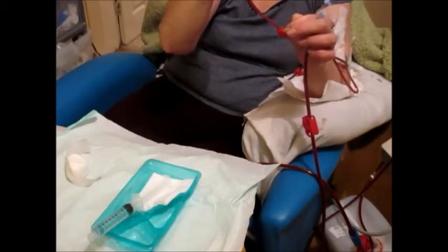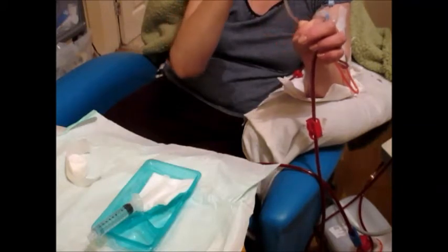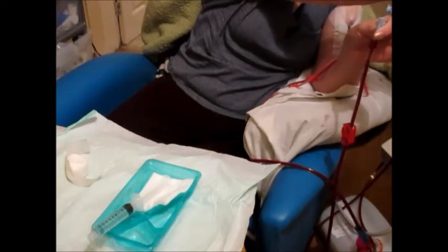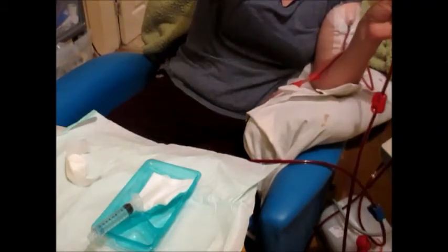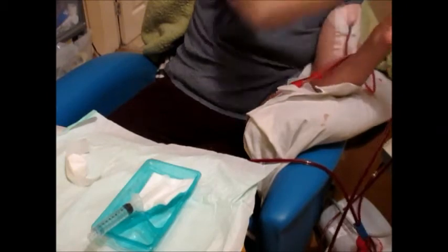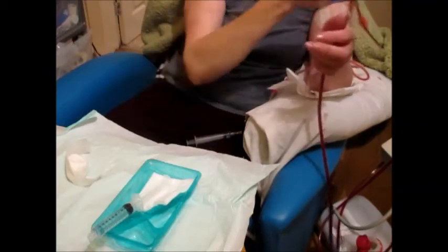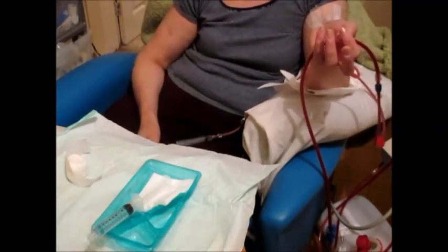Be careful that there are no air bubbles going in. If there are little air bubbles, just pull the syringe up slightly. If you keep the syringe upright as well, you're less likely to introduce any air. Now I'm just going to connect the substitute line back over to the arterial line to wash my blood back. You need to make sure you wash as many of the red cells as possible back, as CKD patients are prone to anaemia anyway.